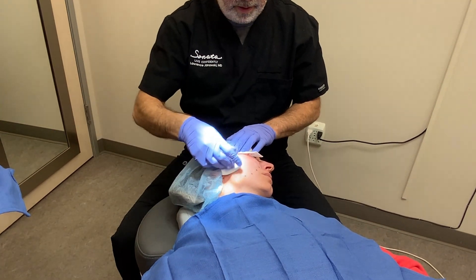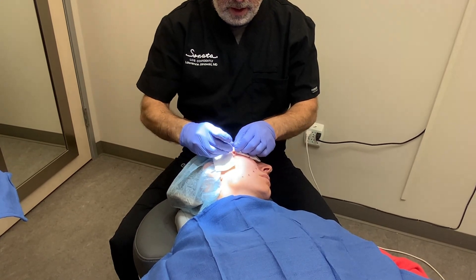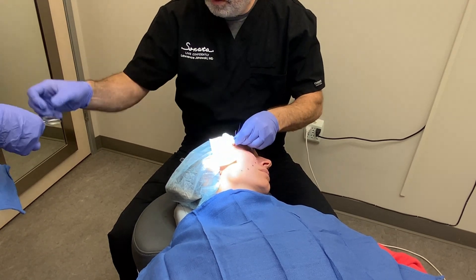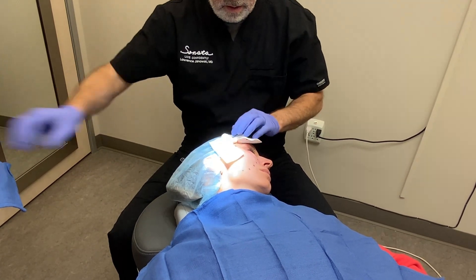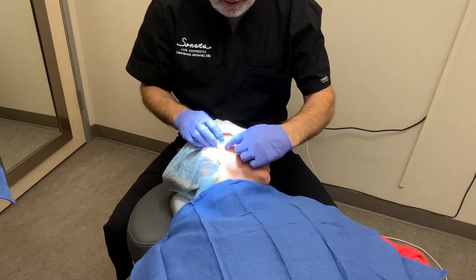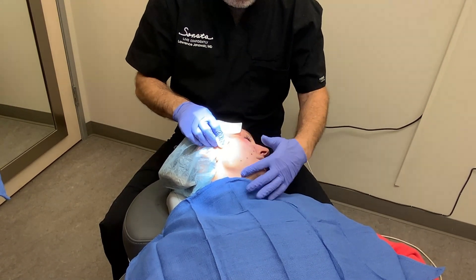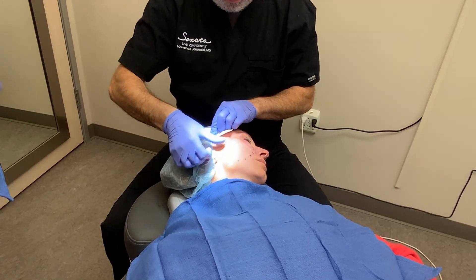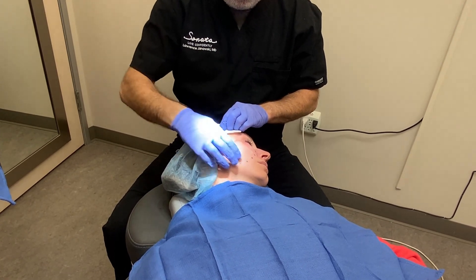This is a reverse, back up into the temple. We'll take our two and you can see how that nicely pulls everything up. Then we'll do a single tie here, and then we'll bury the petites up here, and push down to pop that in. Make sure that our holes aren't being tethered or tugged at — if they are, you can undermine around the hole. Then we'll just cover these and do the other side.